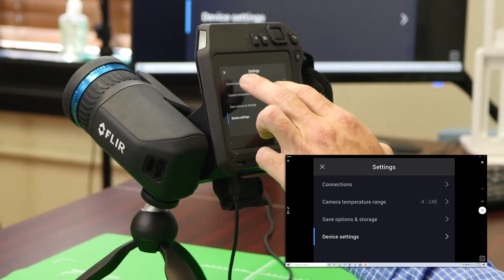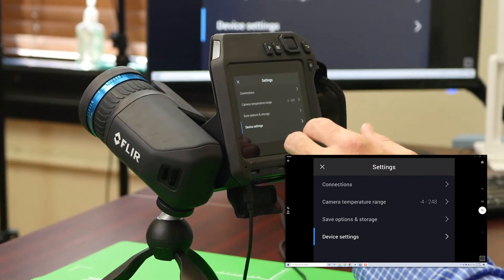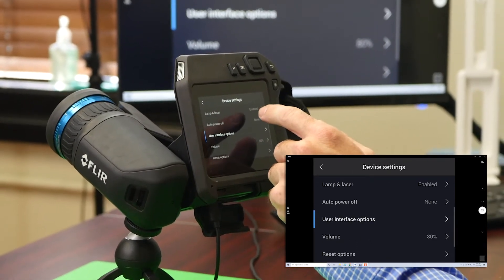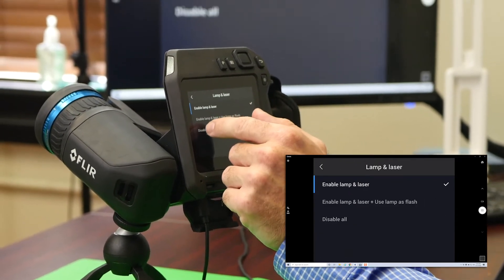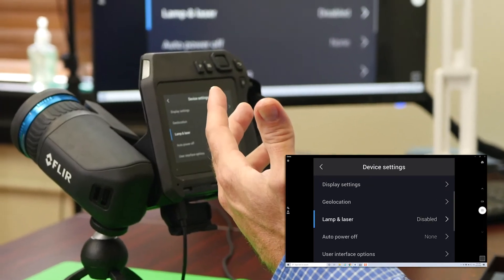From here, you'll see multiple options such as connections, temperature ranges, save options, and device settings. We're going to be clicking into device settings. From here, you'll see multiple other options as far as lamp and laser. For this application, you're going to want to make sure that it's disabled so you're not shining lights or lasers in people's eyes accidentally.